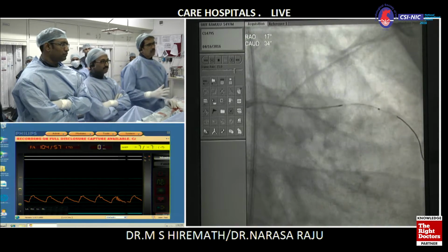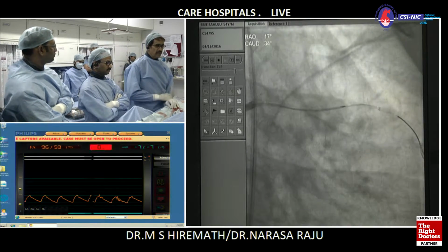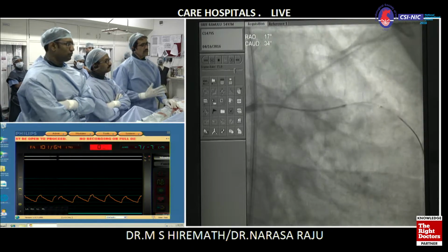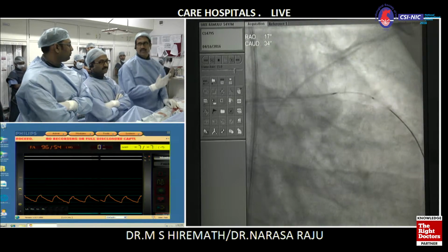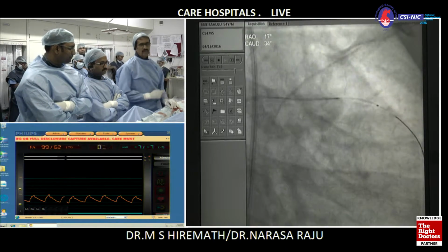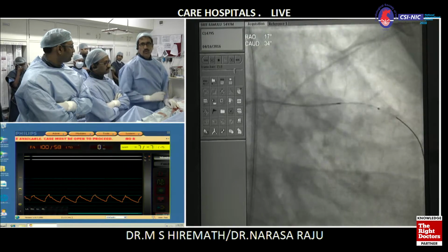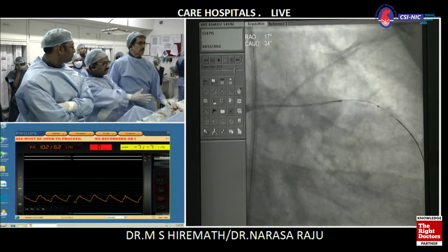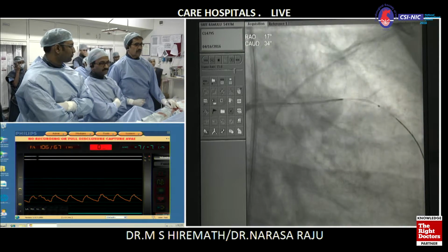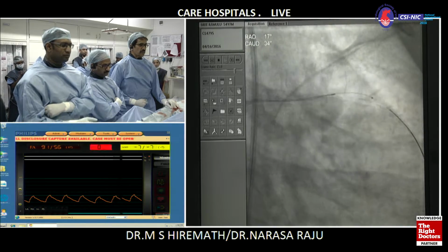A few points here are whether there is disease at the mouth of the side branch. Secondly, the diameter, whether the stent is going to really match the diameter of left main, especially at the back end, and how we are going to achieve the diameter. Today, our largest post-dilatation balloon is only 4.0. So we have to think how we can ultimately match the diameter. So we'll run the IVUS for you. Can we run the IVUS?